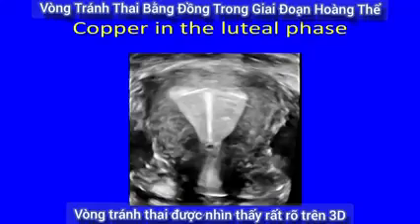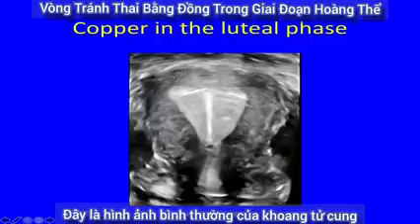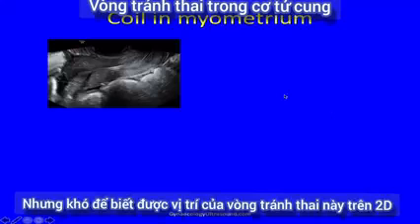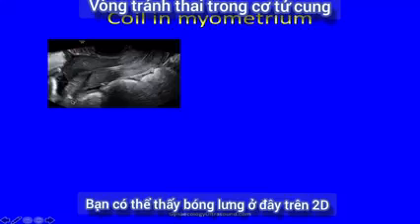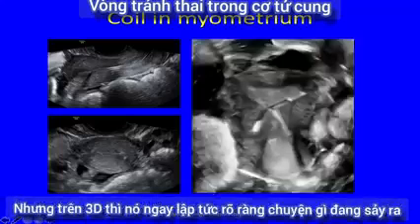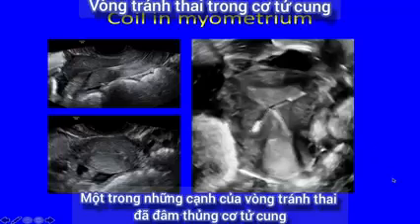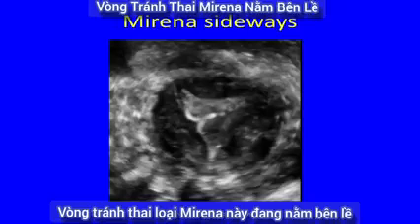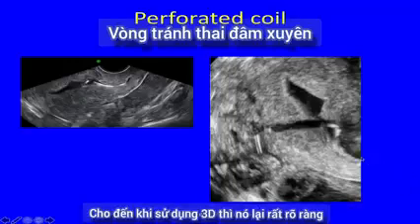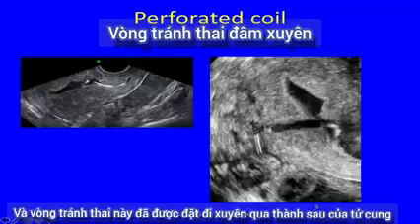Coils show up beautifully on 3D ultrasound. Here is a copper coil in the luteal phase endometrium with a normal-shaped cavity. This coil was harder to know where it was on 2D — you can see a bit of coil and a shadow in 2D, and in the transverse plane a little bit of possible coil. But on 3D it's instantly obvious that one of the arms has perforated the myometrium. This Mirena is in sideways, and again it wasn't at all clear what was going on until on 3D it was obvious — there's the cavity, this is the back of the uterus, and this coil has been inserted through the posterior uterine wall.